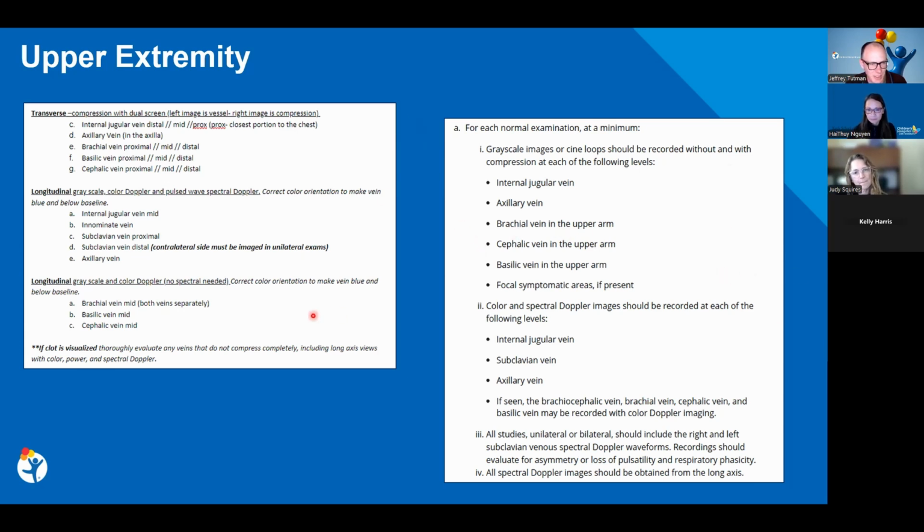And then the other protocol question I had is we have a hard line from brachiocephalic to SVC. If they are worried about SVC occlusion, sometimes I feel like we can see the SVC depending on the body habitus, but we have made that more of an echo type question. If they're worried about SVC something, do you defer that, or are you willing to look at that? We refer to echo usually. Well, brachiocephalic is usually our cutoff, but yeah, depending. Yeah, same. I don't think we routinely look at SVC enough to even do it confidently. Right. Yeah.